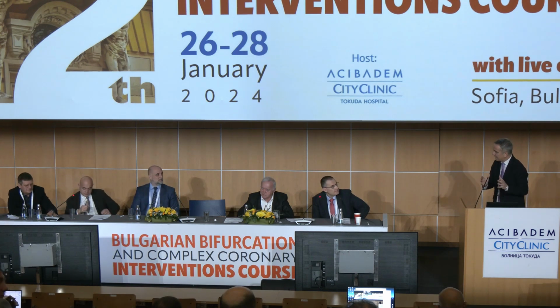And people are filming at 25 frames per second, and they say, oh, I'm not seeing well. And I see, well, you are seeing pretty well, the picture is really good. Don't burn the patient and don't burn yourself. This is how it starts, and then come the protection devices. I agree with you. The first thing is to tune your machine to the lowest possible dose.